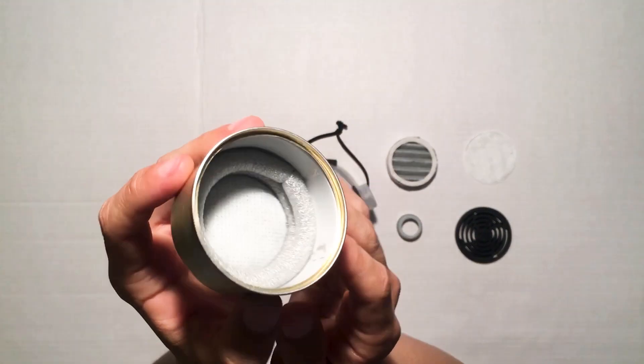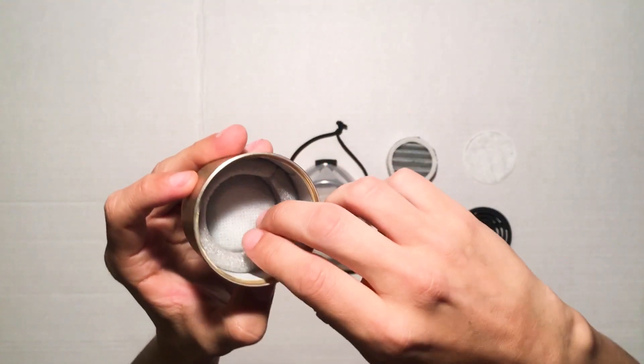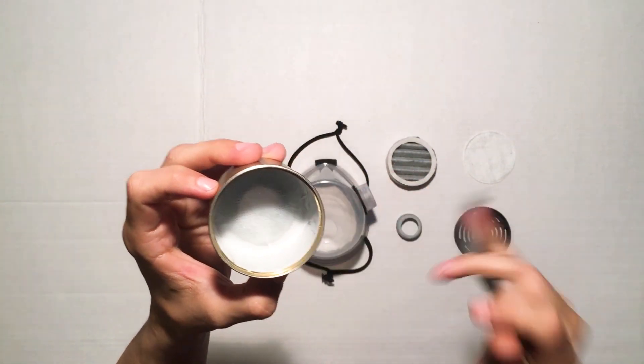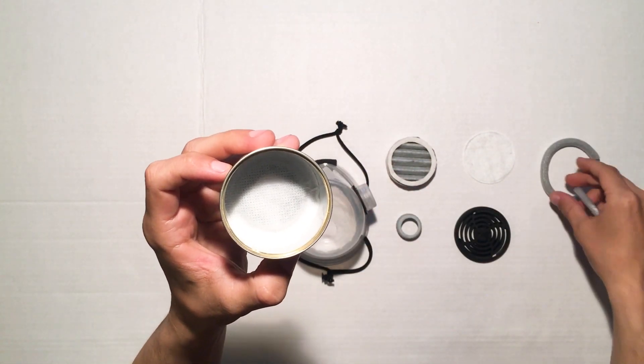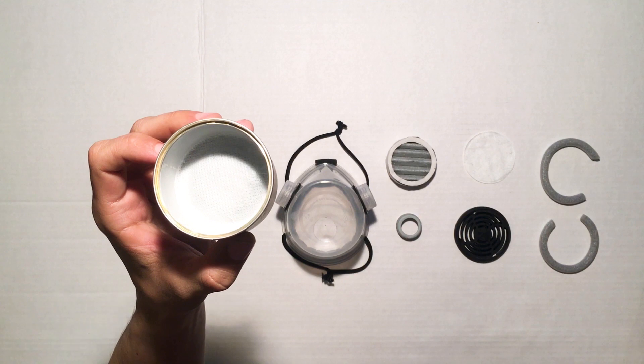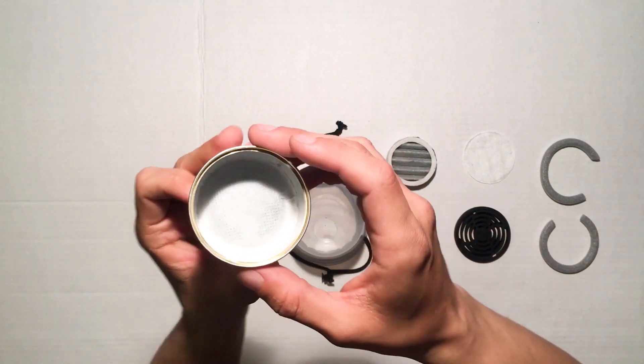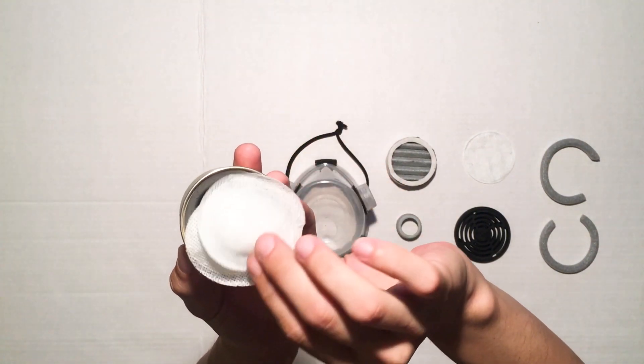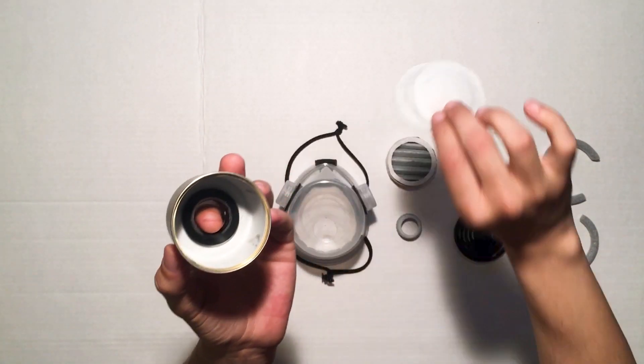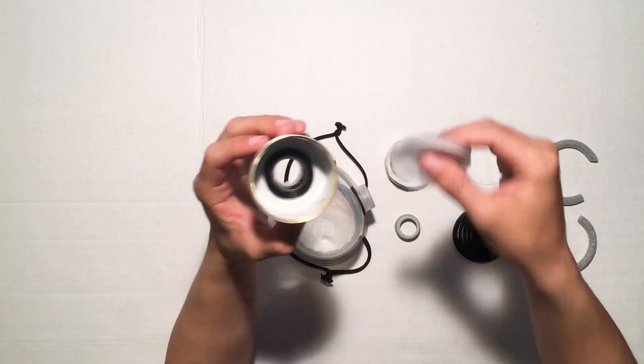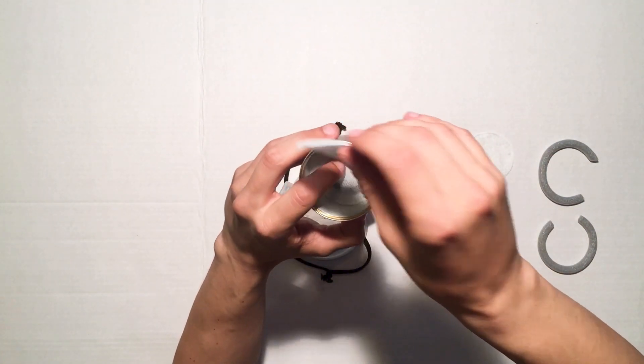A couple of foam spacers that form a chamber to improve the air flow. And below that, two layers of pre-filter material from the same vacuum cleaner bag. Let's pop that back together.